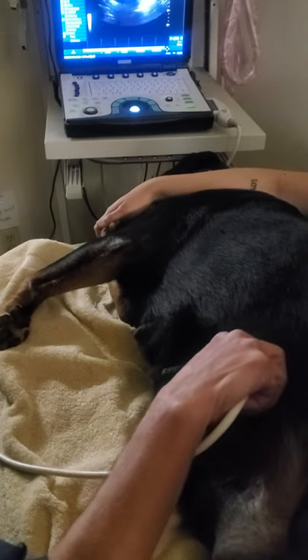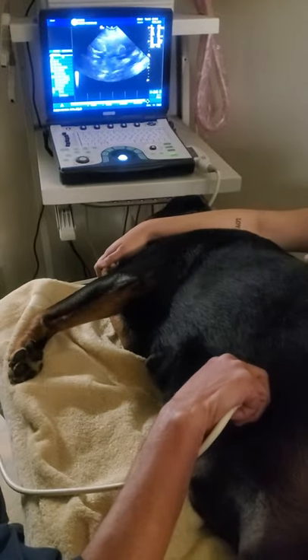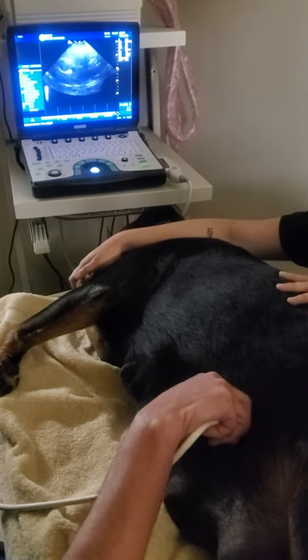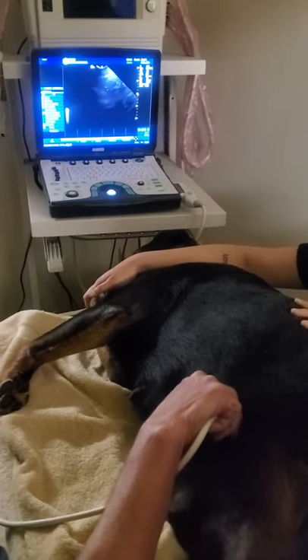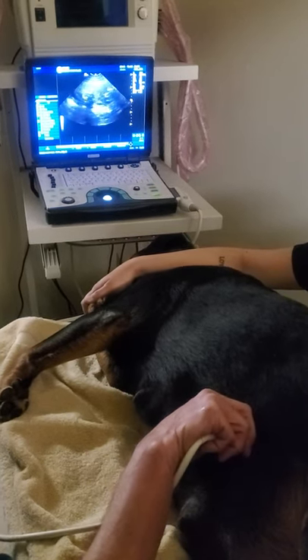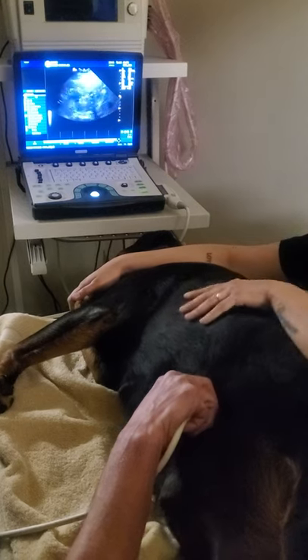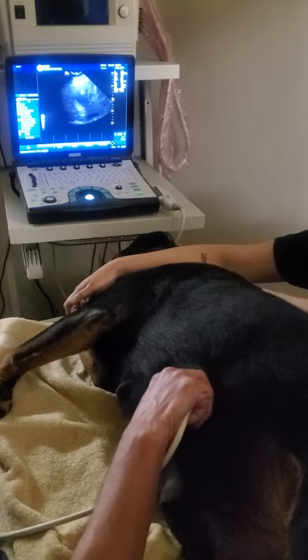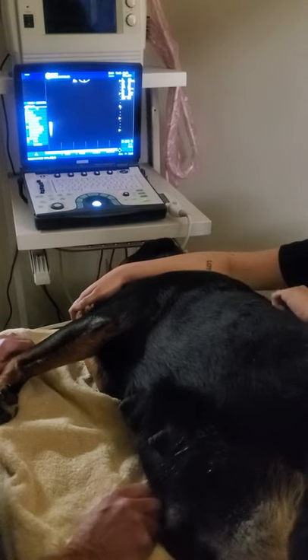You're okay, good girl. There's two heads right together right there. Very good, Duchess — very tolerant. That's the fun stuff. We got rolling on the other side. Good girl, mamas.